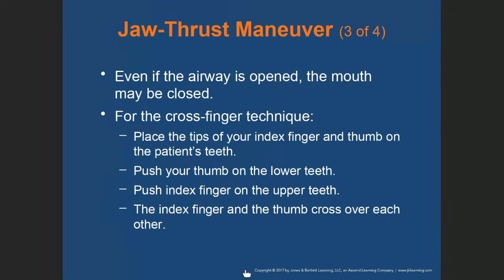Even if the airway is open, the mouth may close for the cross finger technique. So there are some patients in which you may have to use your cross finger technique to create a little more space in the airway, right? To check for fluid or foreign body, or to even insert an airway adjunct. We will practice this in the skill sessions.